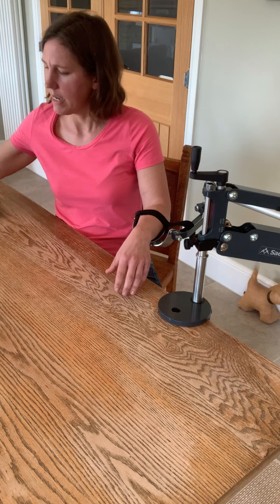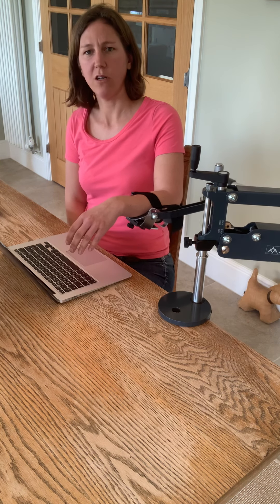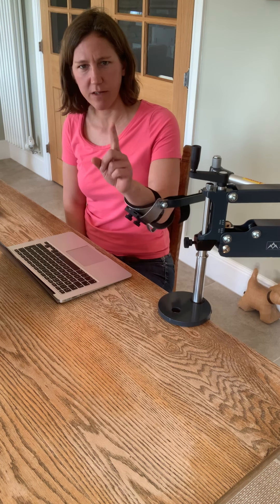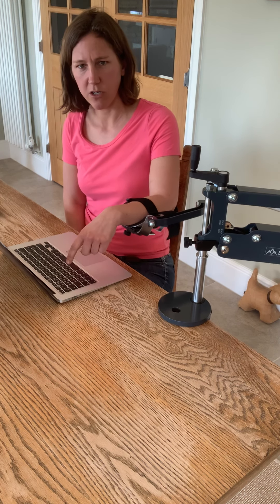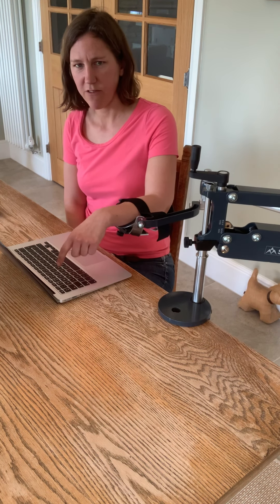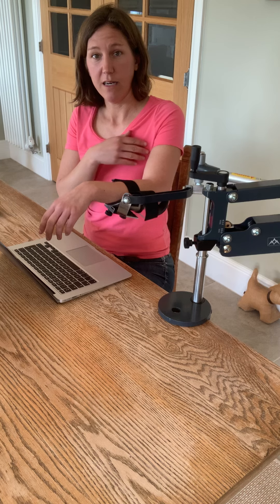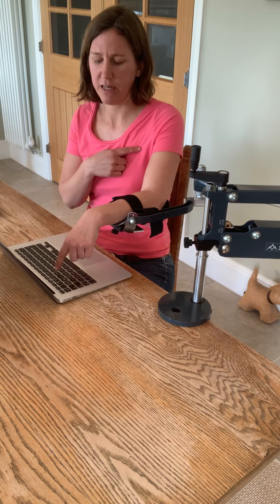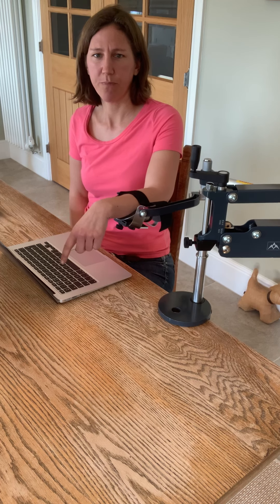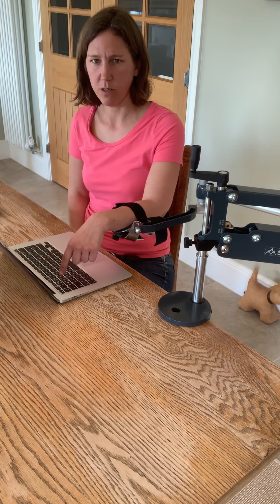Another task that everybody does — whether it's a tablet, mobile, or a keyboard. By de-weighting the arm I'm not having to use a lot of effort to lift my arm up, hover my finger over the keyboard, and then actually practice even just one finger touching, pressing and typing. If you turn the tension handle to lift your arm up, you then have to work quite hard to bring your finger down — so this is almost like adding a weight to your gym program, working against that resistance to keep your arm down, really giving your shoulder a workout as you type.